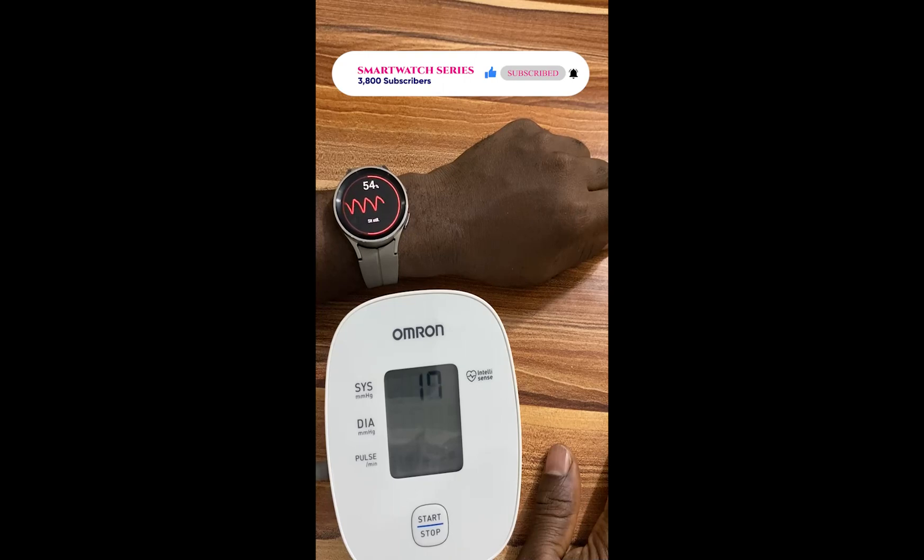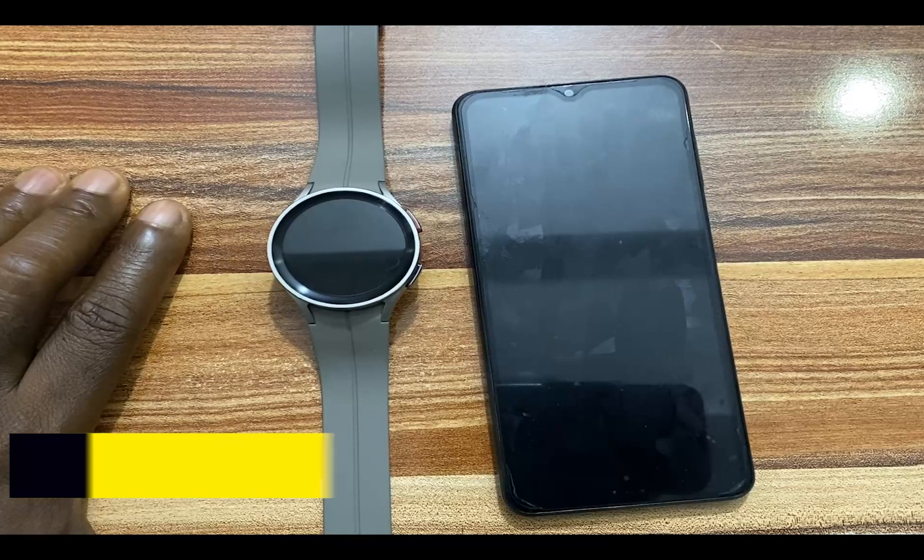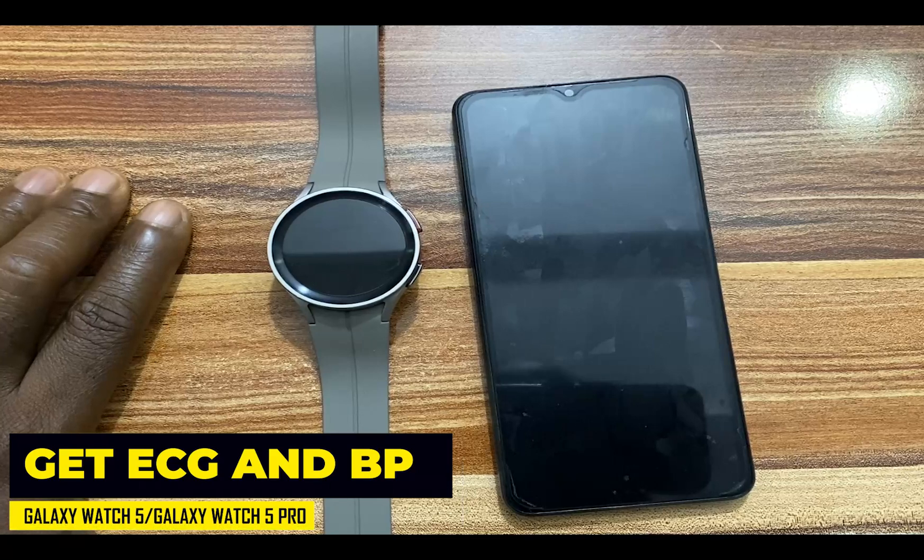Fortunately and thankfully too, a user that goes by the name Dante63, a senior member at XDA Developers, has been able to modify the Samsung Health Monitor app. With the modified app, you can actually get ECG and blood pressure measurement features on your Galaxy Watch 5 and Galaxy Watch 5 Pro. And in this video, I'm going to show you how to do just that.